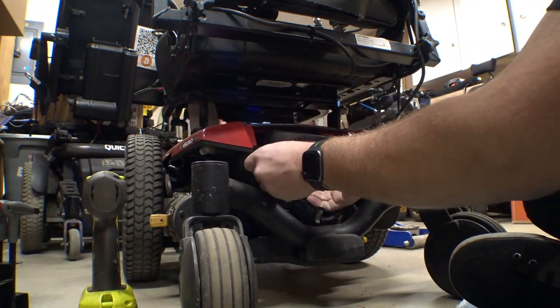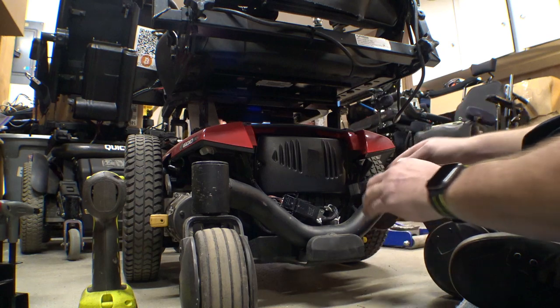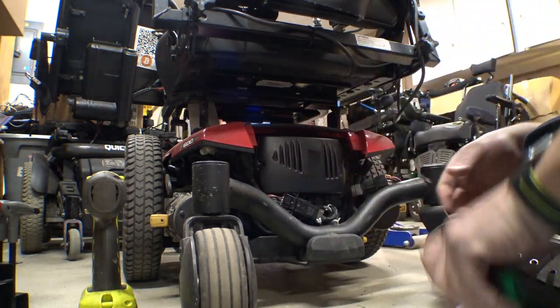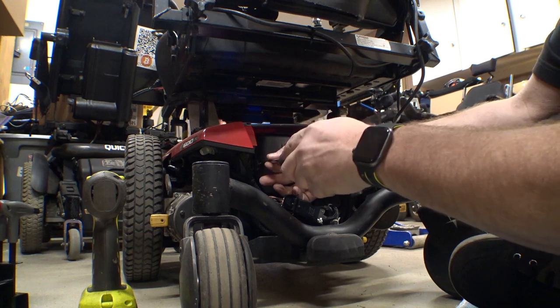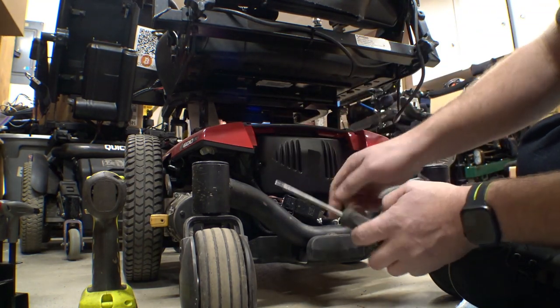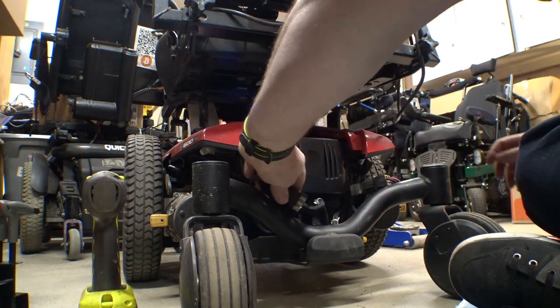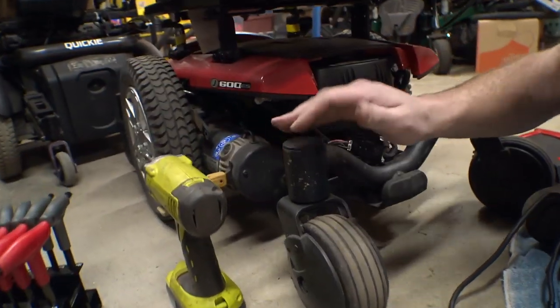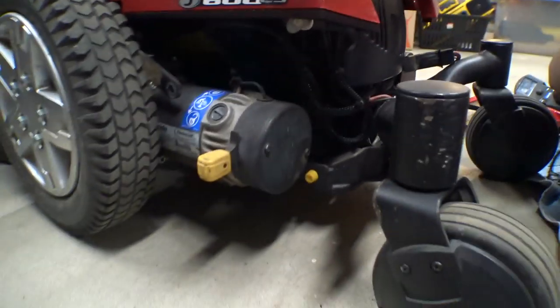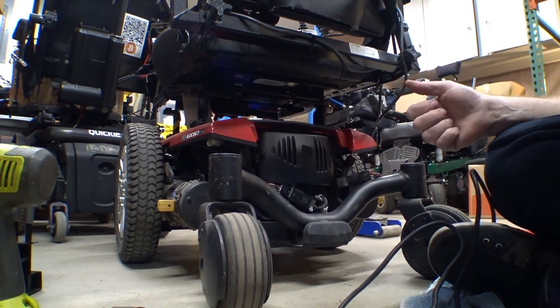There we go. Throw a screw in here. Could turn this thing into a soccer chair — it just has a van seat on it, which is what they call in the industry just 'van seat.' It's non-rehab seating. This wheelchair is essentially just a scooter that takes the form factor of a wheelchair. There's a lot of space around this controller for heat dissipation. I can probably take the cooling fans off of my old Q6 Edge ones and get some airflow down here. I'm not sure if the controller is set up to work with these massive motors — these are clearly not designed to be in this chair. But soccer, right?